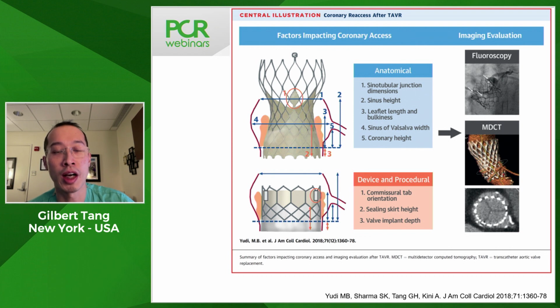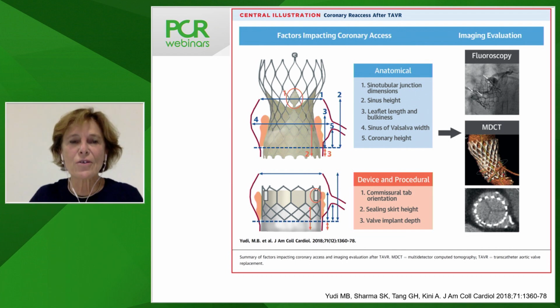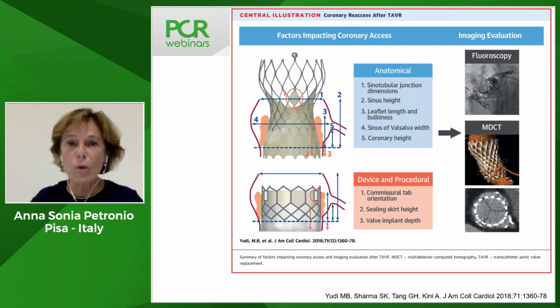So it's not a hard and fast rule about what left main height specifically will be concerning or exclude a patient from TAVI. Based on my experience looking at a lot of CT scans, generally the left main height ranges from as low as about 5 to 6 millimeters all the way up to above the sinotubular junction. So it has a really large range of anatomy. You have to look at it, like what Dan said, individually for each patient. Yes, I perfectly agree. When they give us all the measurements, you have to look at the whole root, not only one measurement.